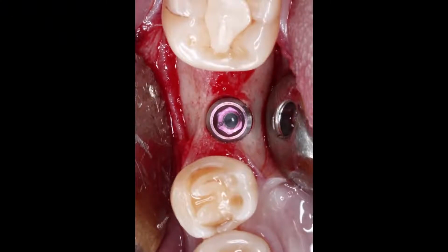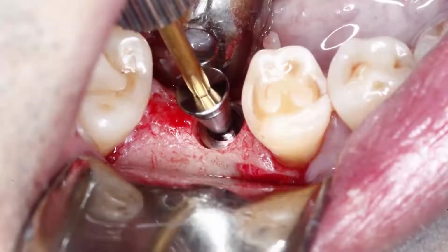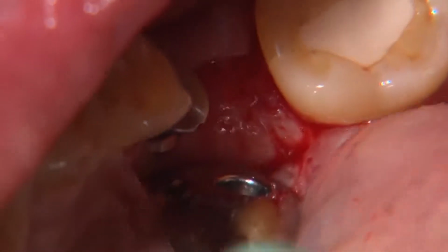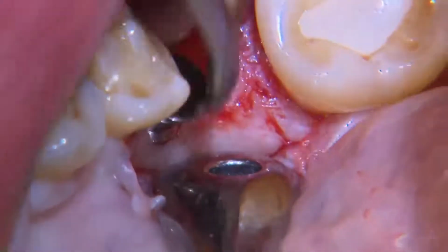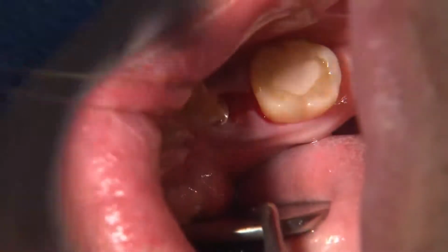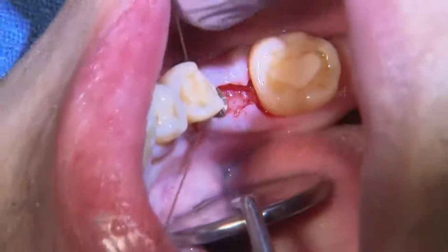the radiograph. I elected to do a one-stage procedure where I want to use a healing abutment and not a cover screw. So a healing abutment goes through the tissue, the tissue heals around it, and you don't have to come back and uncover the implant. And once the healing abutment is on there, I'll go ahead and place a couple of interrupted sutures. In this situation, I used, again, a chromic suture.